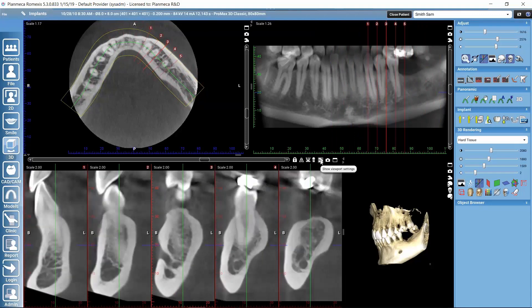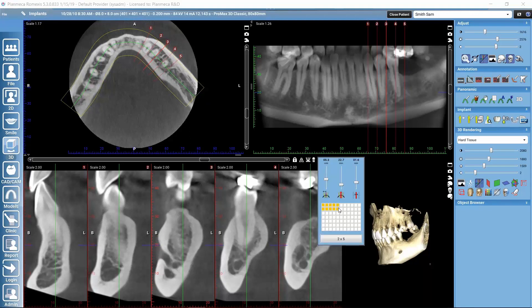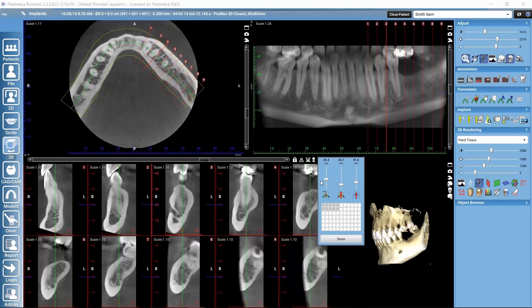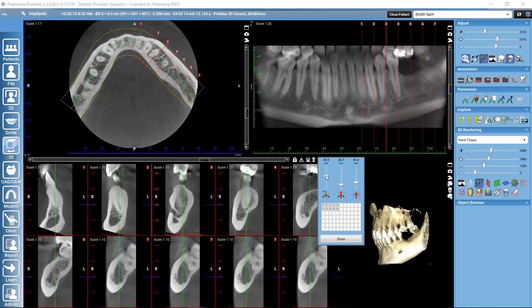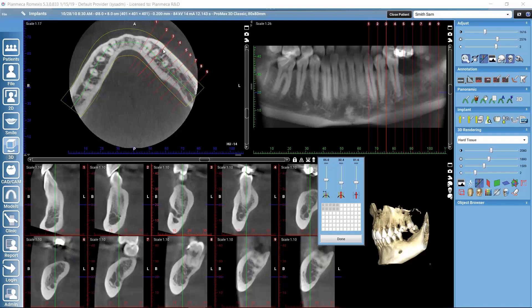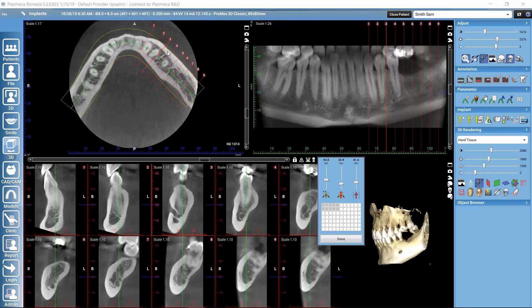The normal slice adjustments apply here too. I can open the viewport settings next to the view and hover my mouse over the grid to select how many cross-sectional slices I want to view simultaneously — for example, 10 slices. I can also change the distance between adjacent slices and adjust the width of the cross-sectional slices, which changes the length of the red indicator line. And I can change the slice thickness of each individual slice using the third slider.